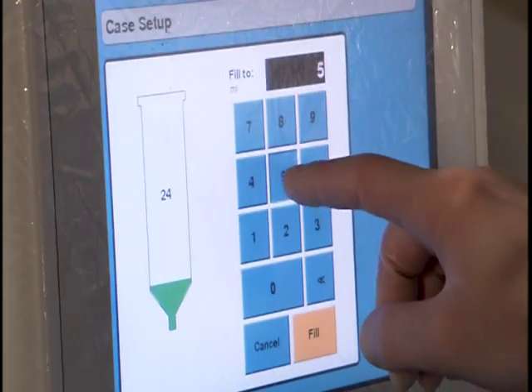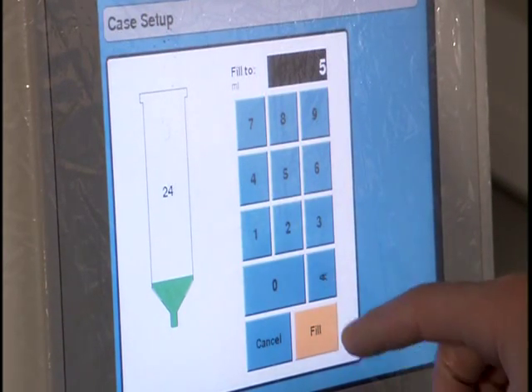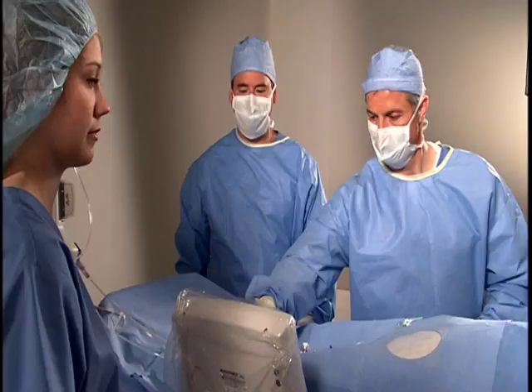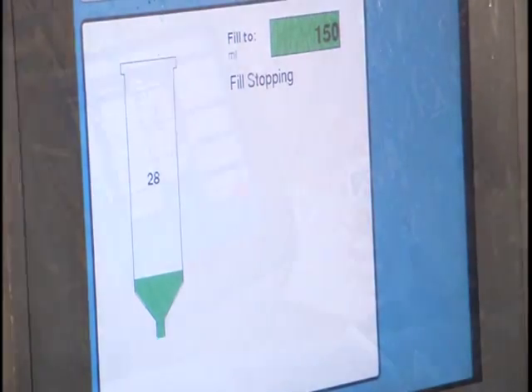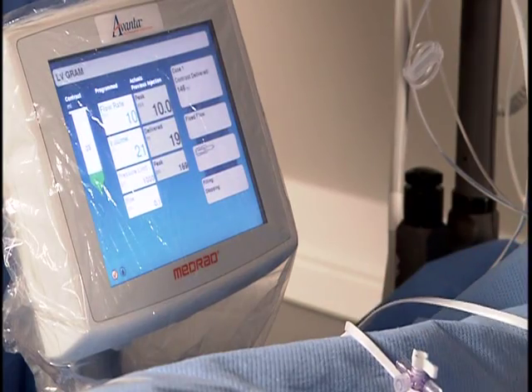If you program an incorrect number when entering the volume, you can press the left arrows to clear the last number. Touch Cancel to exit the fill syringe screen. In either fill option, you can touch Stop or depress the hand controller at any time to stop the filling process.